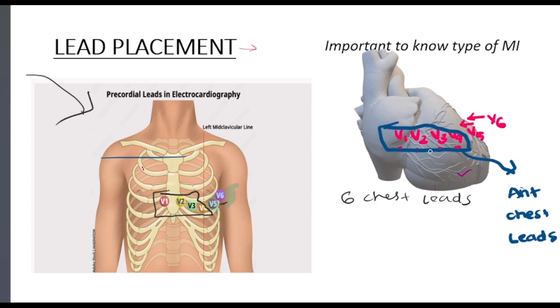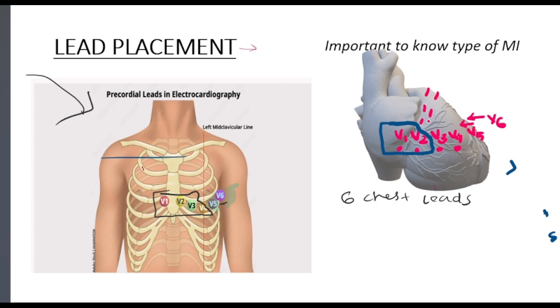But if you specifically ask me which leads definitely show ST elevation, then that is V3 and V4, because V1 and V2 also face the septum of the heart. So assume here we have the septum.